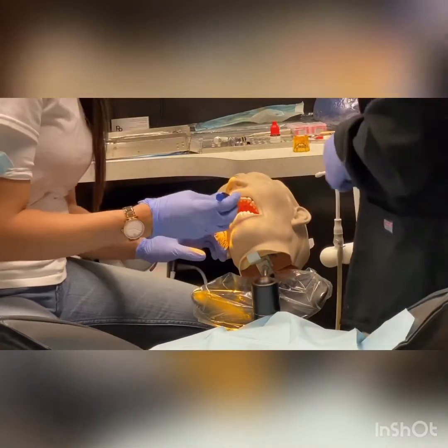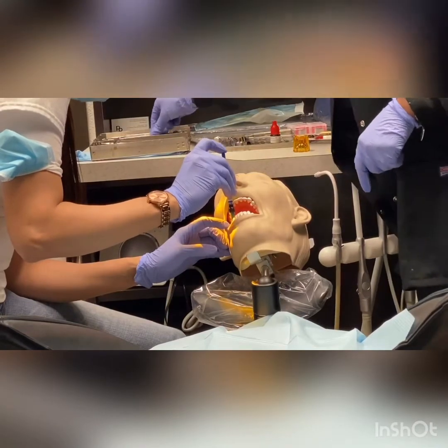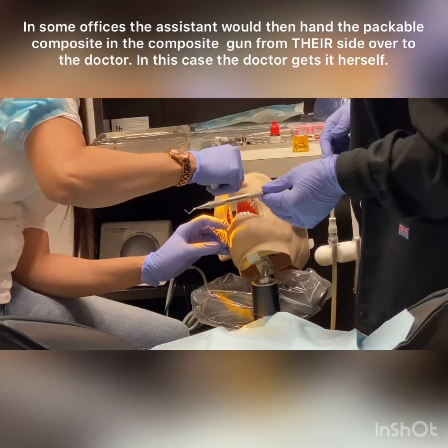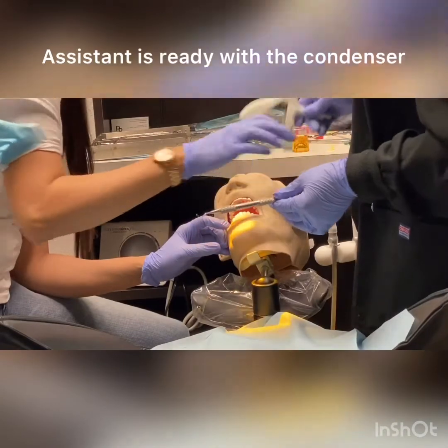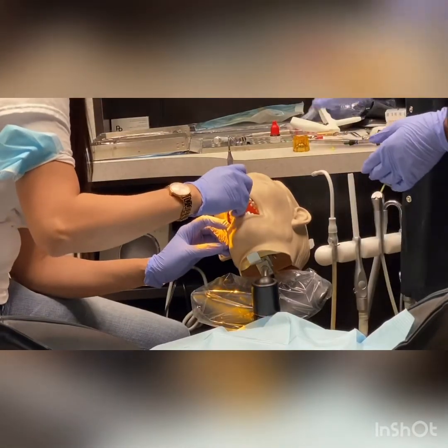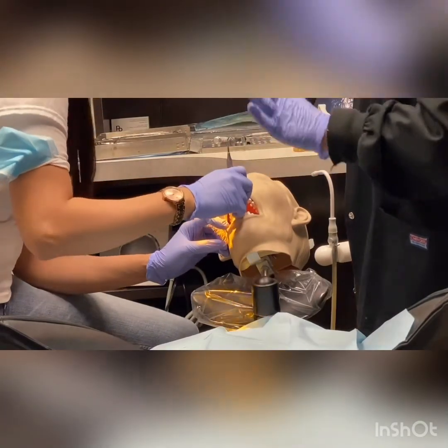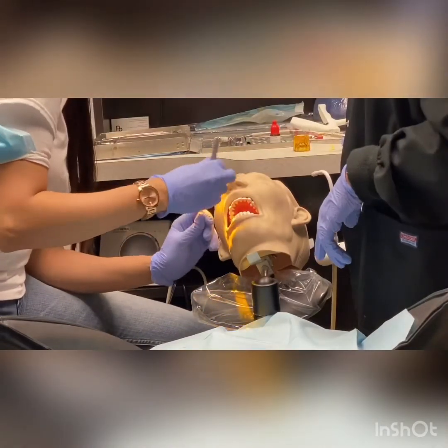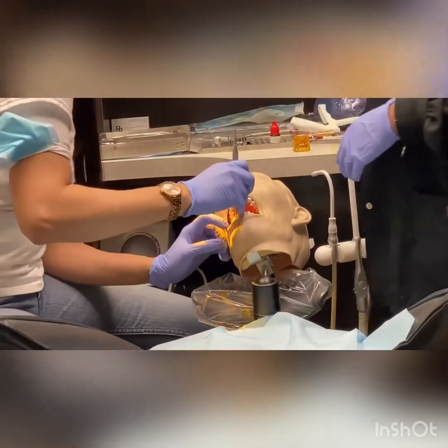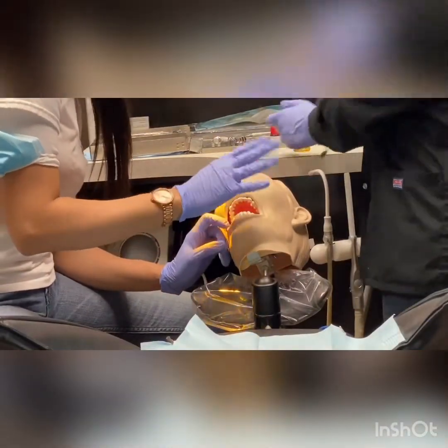Your hand needs to be the exact way I put it in the mouth, so I'm not having to maneuver and change anything around at that point. And your composite behind you too. In our case, the composite is on the doctor's side, and in a lot of offices the assistant would grab that from their own side. I handed her the condenser first because she wants to pack that composite down into the cavity. Now I'll hand her the ball so that she can shape it up really good.